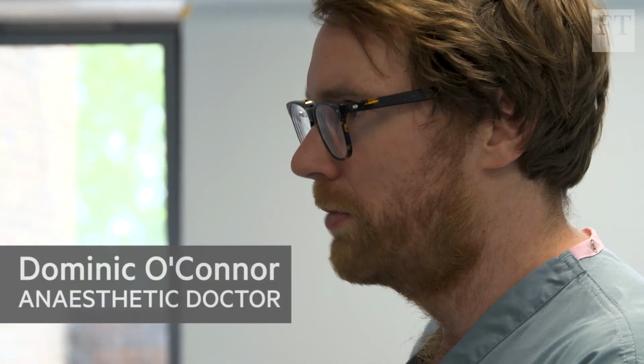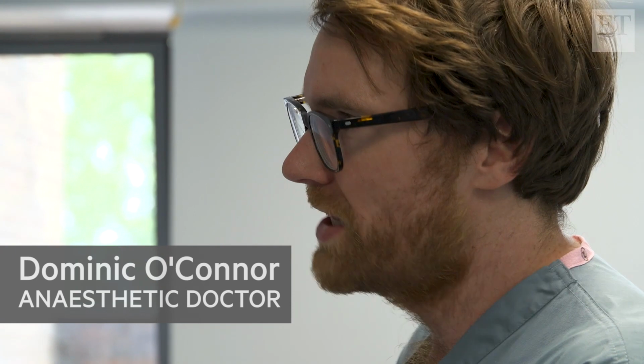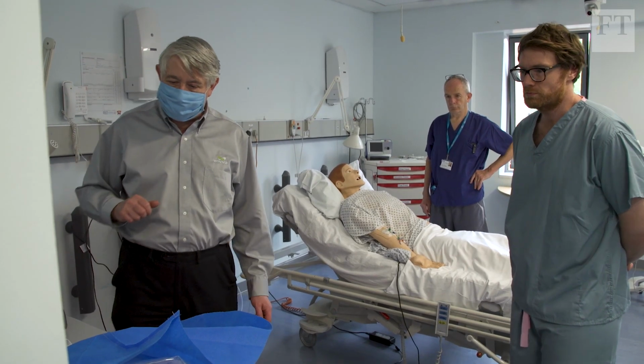How easy is it to have verbal communication with this? You'll try it on in a minute, hopefully. Because that's something that we found a particular challenge of working with the particular PPE that we have to at the minute. Yeah. Not only is your hearing muffled and distorted, but you lose any lip reading element and facial expressions. When you've got a team that's working together in a busy environment and there's a lot going on, facial communication is very important, and people lip read a lot more than you think they do. So if you'd like to try it on.